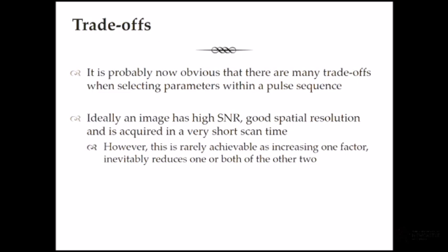So as I said, when you're the radiographer sitting there running these scans, that's the sort of juggling that you're doing when you're thinking, okay, this is not looking the way I think it should look. How am I going to improve the image quality, or how am I going to get more spatial resolution? That's the trade-off that's going on in your mind when you're trying to improve the image quality.